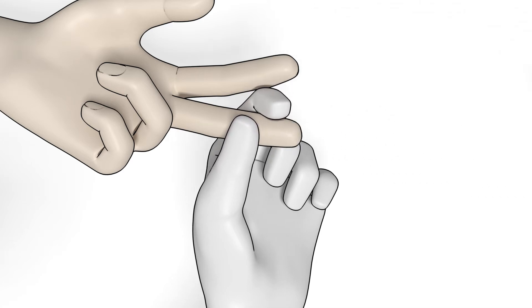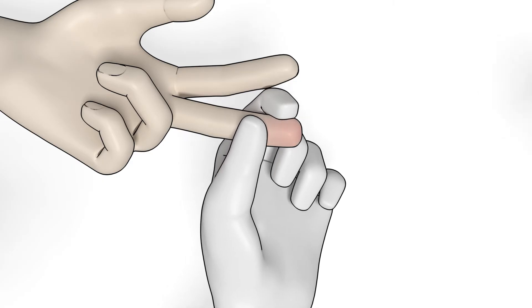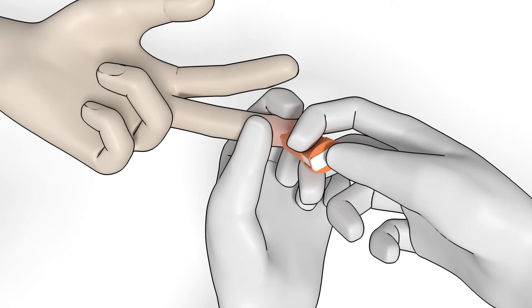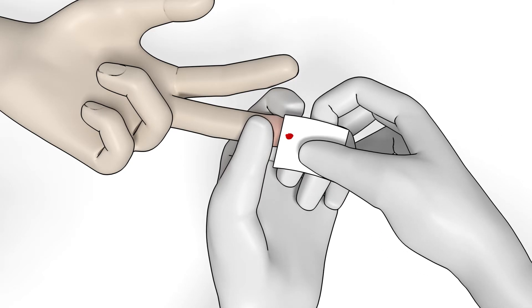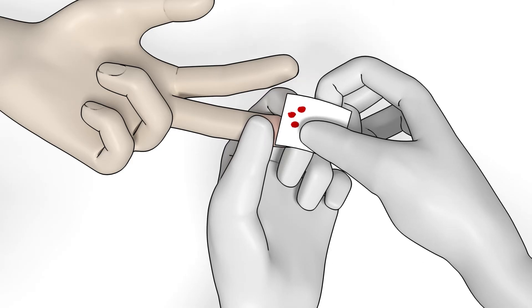Stimulate blood flow by applying a light pressure from the top of the knuckle towards the fingertip. Apply light pressure to puncture the fingertip using a high-flow lancet. Wipe away the first two to three drops, then press lightly until another drop appears.